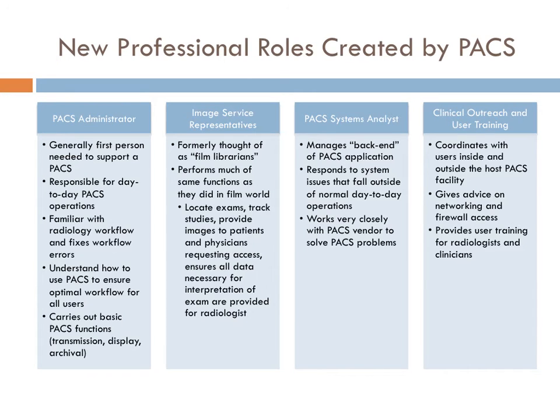So when you see PACS being implemented at your hospital, most hospitals have already implemented a PACS, or if not, they're in the process. You'll notice that a whole workflow can really change, and new professional roles are created simply by the implementation of a PACS system. We're just going to review a few of the roles that can be created.